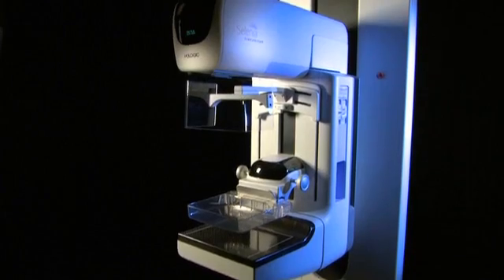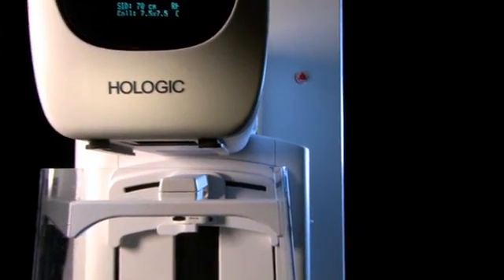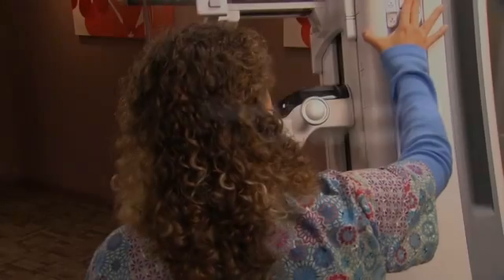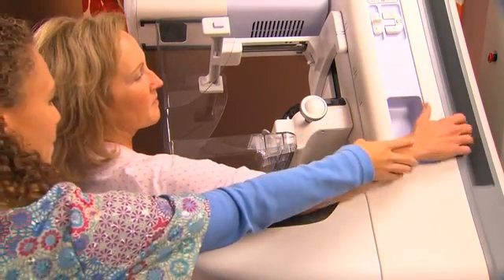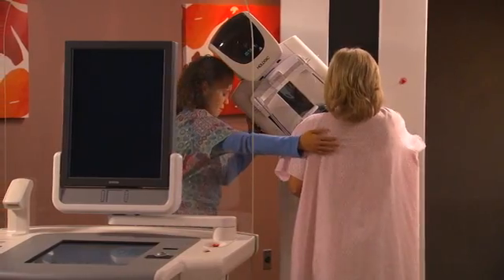Selenia Dimensions is the next generation of our Selenia digital mammography system. It enables you to capture both 2D mammograms and 3D tomosynthesis images using one platform. The gantry and C-arm are sensitively designed, with ergonomic features that maximize ease of use for the mammographer and minimize discomfort for the patient.